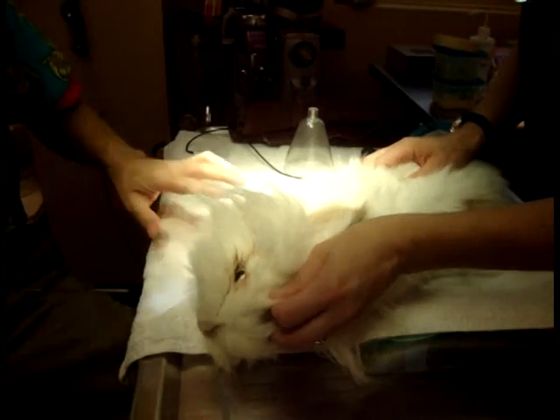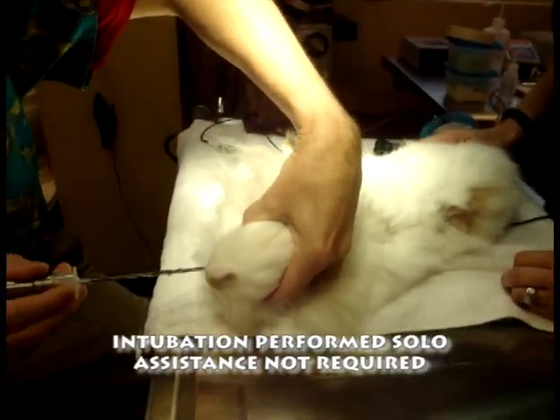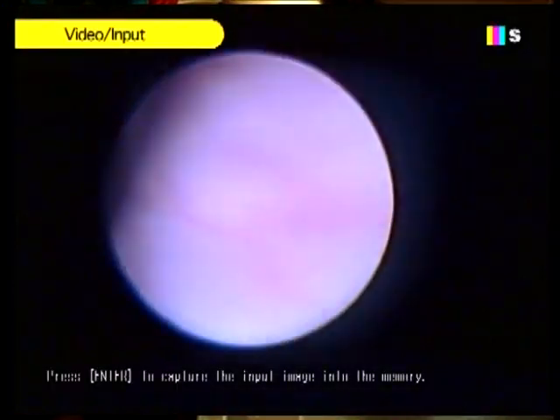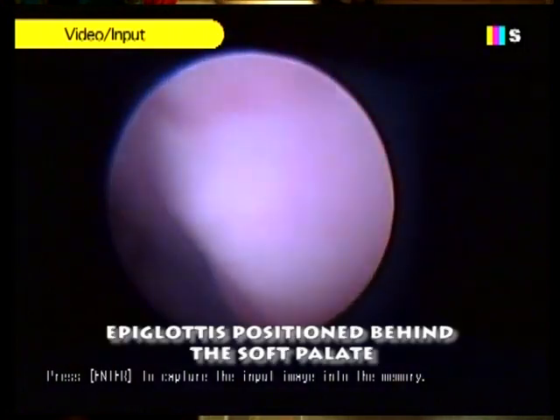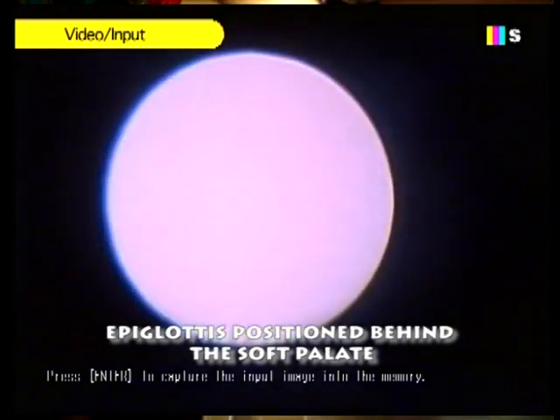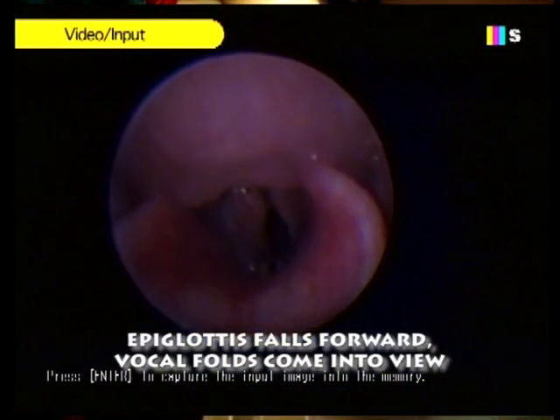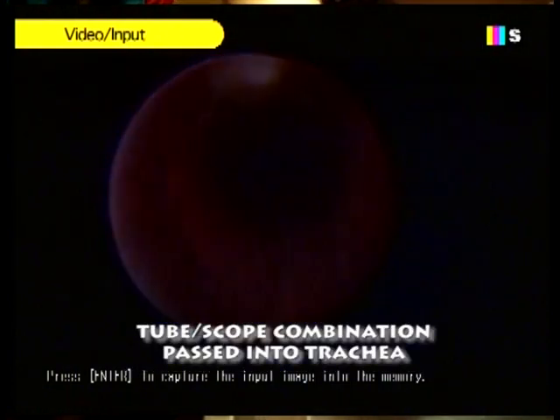Turn on my light source. I typically intubate with a rabbit in lateral, and I'll go in and first try to find some landmarks — in this case, the roof of the mouth. I'm heading back, and I can see where the glottis is engaged with the soft palate. I'll press against the soft palate with the end of the tube, the epiglottis falls forward, and I can see the arytenoids. Then I pass right through them into the trachea, and that elicits a cough.